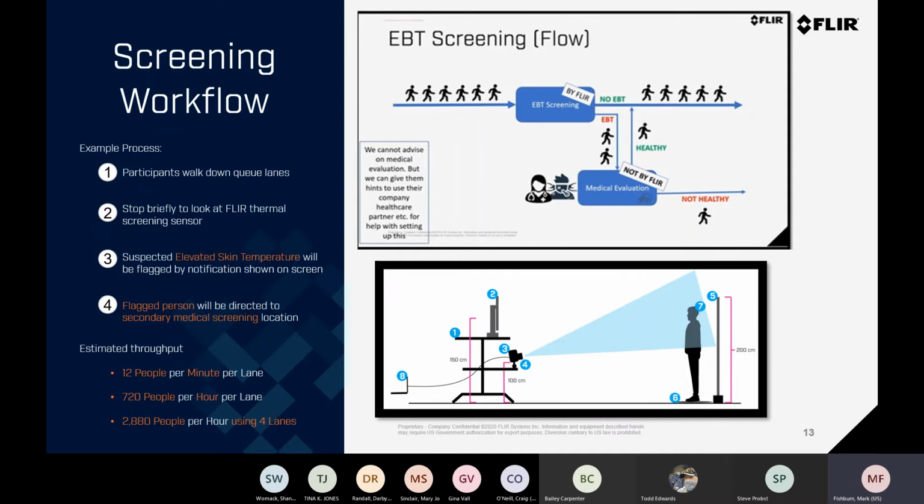Recalibrate on it, like I said, every now and then. If you change batteries on a camera that's not powered hardline, you may have to redo the calibration on a couple of employees and then move down the line. If it's hardlined or kiosk, you don't have to do that.